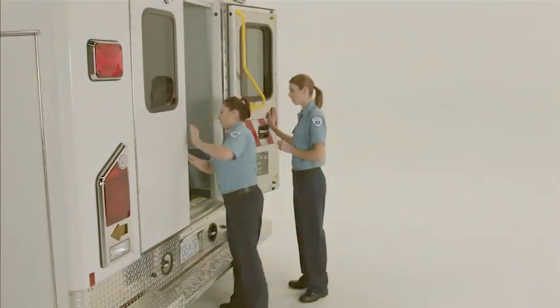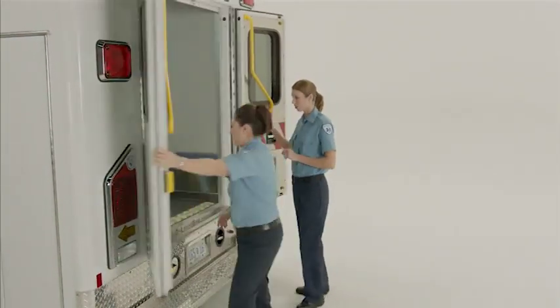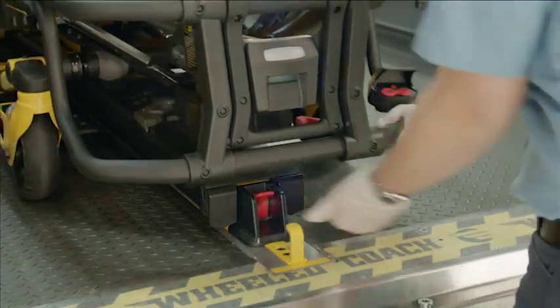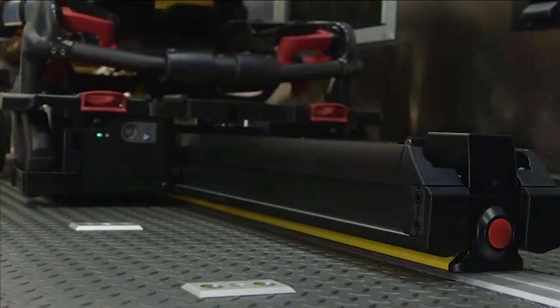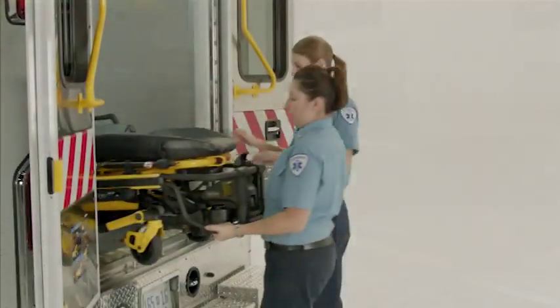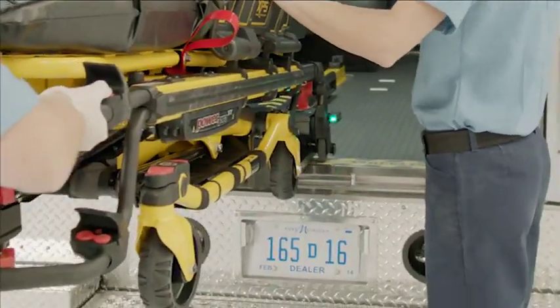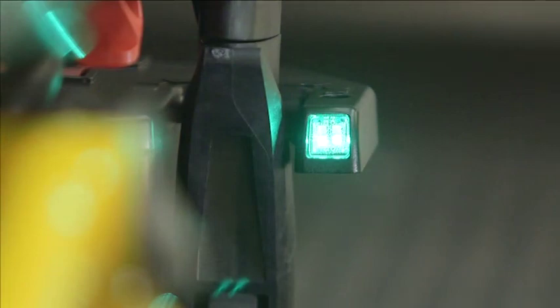To unload the compatible PowerPro cot, first press and hold the red release lever at the foot-end of the PowerLoad system to disengage the cot from the patient compartment. Next, grab the cot at the foot-end and guide the cot out of the patient compartment until the head-end LED indicators turn solid green.